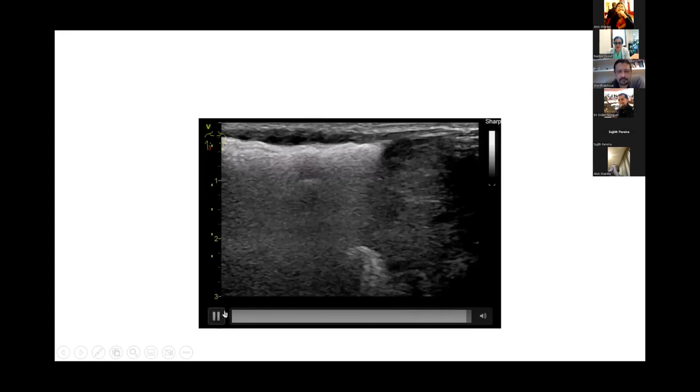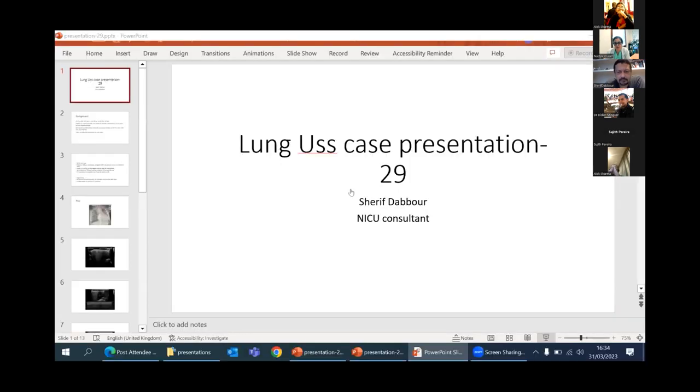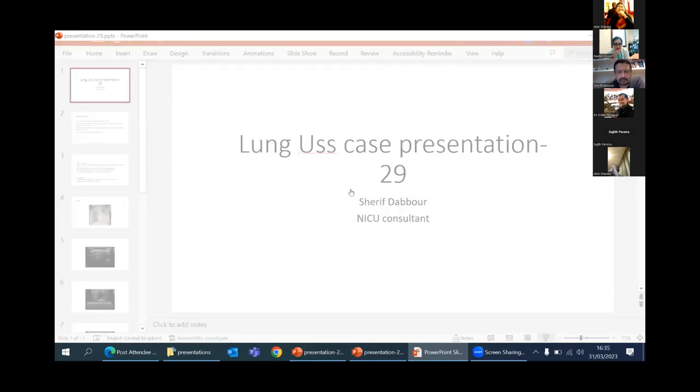And you'd have to move the probe around for this area where you were asking, is it an A-line or is it not? It might or it might not be. And only you would know when you're actually rescanning, maybe moving your probe over to vertical, horizontal to get a global overview. But if we go back to the image. Sorry, it stopped screening. I will share it again, sorry.